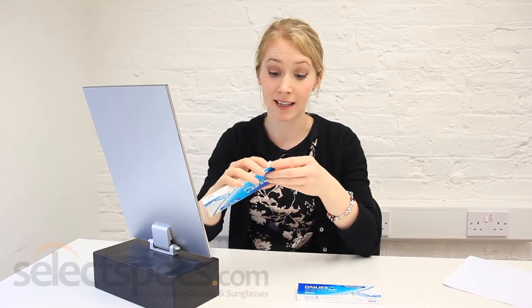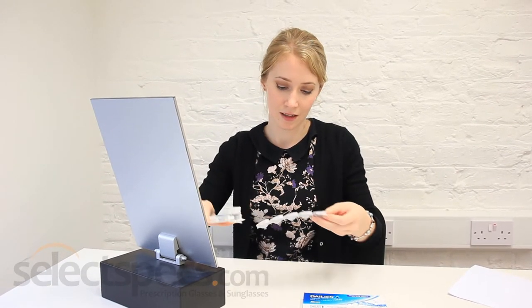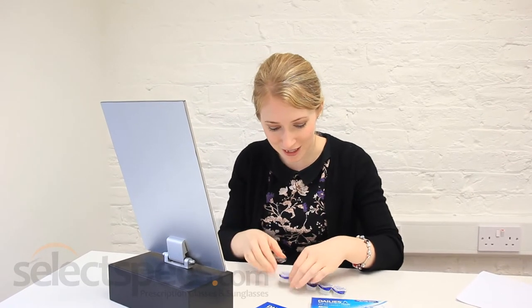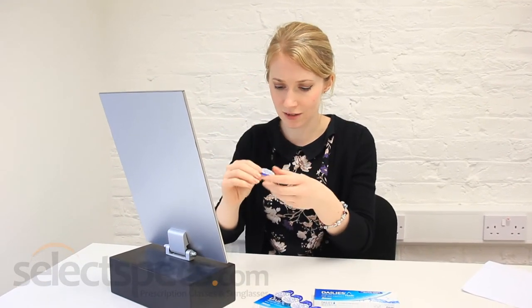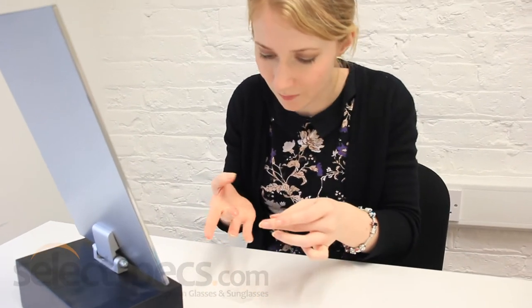I got 5 pairs and they're daily ones. The shop was helpful yesterday and showed me which way was the wrong side up and the right side up, so hopefully I can distinguish between them today. With daily contacts, they all come already in saline solution. I think that's the wrong way — right, I think this is the right side up. So here I go.